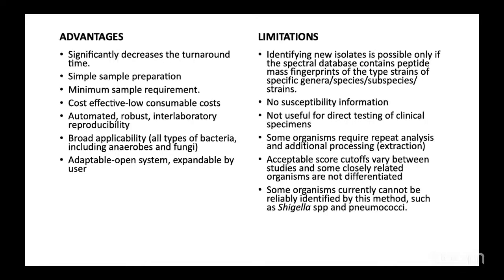Now, what are the advantages of using these automated technologies in bacteriology? One, it significantly decreases the turnaround time. The sample preparation time is very limited, and there is no very complicated requirement. When we have the growth, even on the next day in the lab, we inoculate the MALDI-TOF within a few hours, and by about 11 or 12 o'clock your report is ready.